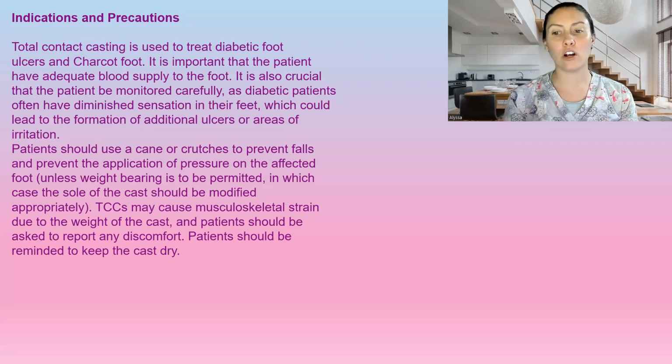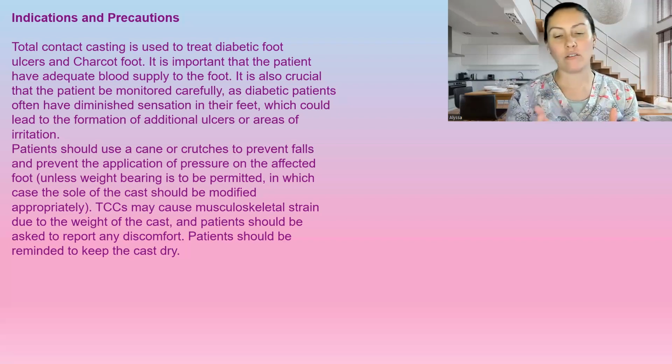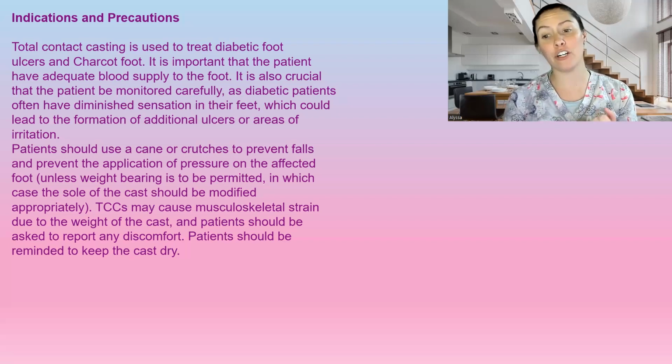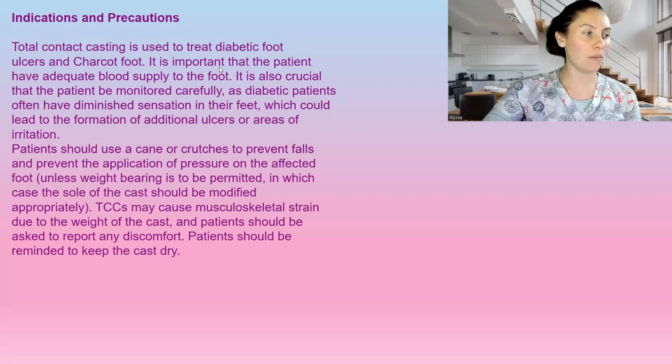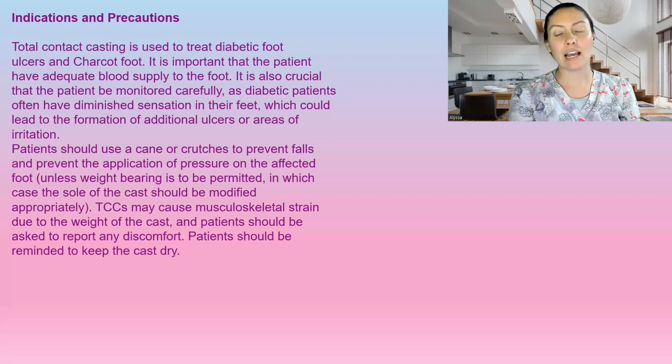Patients should use a cane or a crutch to prevent falls and prevent full pressure on that foot. Now, if weight bearing is permitted, we just need to make sure that we're making certain modifications so that you can do so. Total contact casting may be a strain to the muscles due to the weight of the cast. Patients need to be told that they need to report any discomfort, and patients should be reminded to keep that cast dry. Okay, we can't be getting it wet. A lot of times we'll put the patient in an air boot with the total contact casting so they can actually walk.